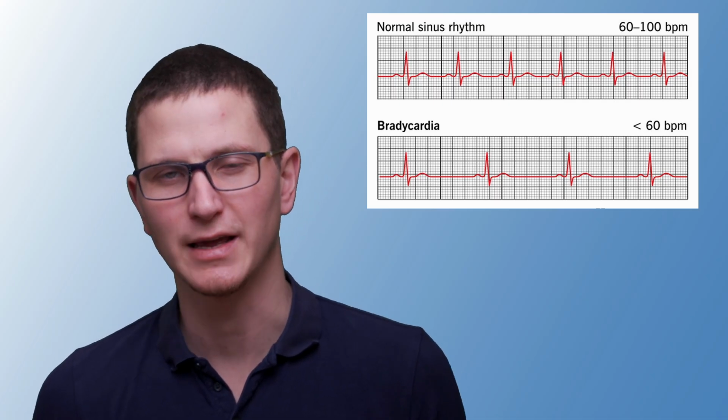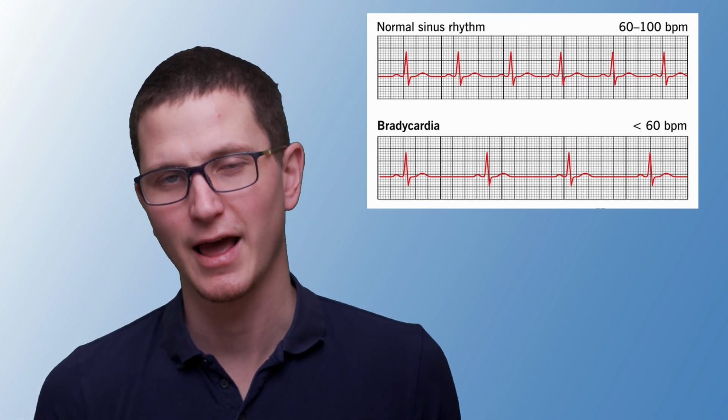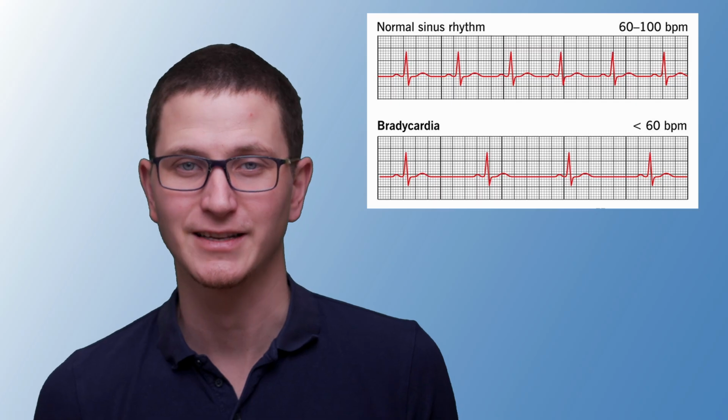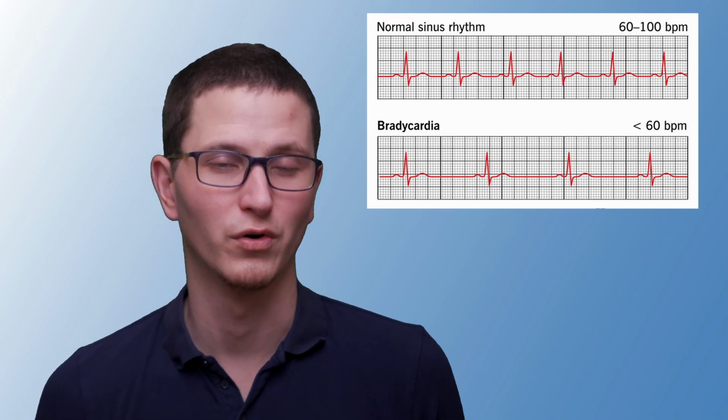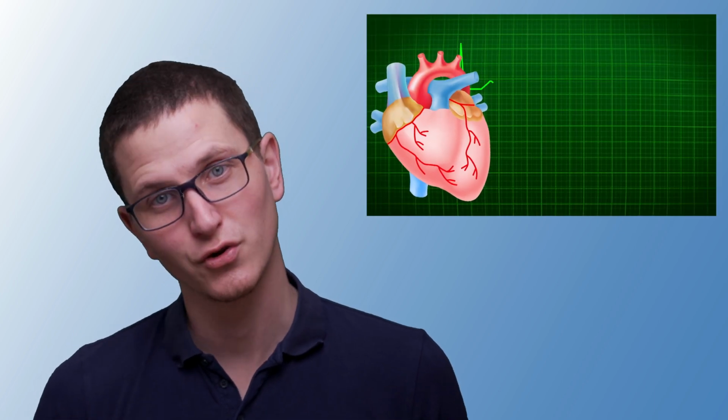Do we want to shock a PEA, right? Do we want to stop that? No, we don't, because what's happening in a PEA is that we could have pulsatile blood flow, but we don't because the heart isn't actually contracting hard enough or isn't contracting at all, but at least the electrical conduction is trying. So remember, an ECG is not movement of blood flow or anything like that, or even movement of the heart. It is the movement of electricity conducting through the heart, right?